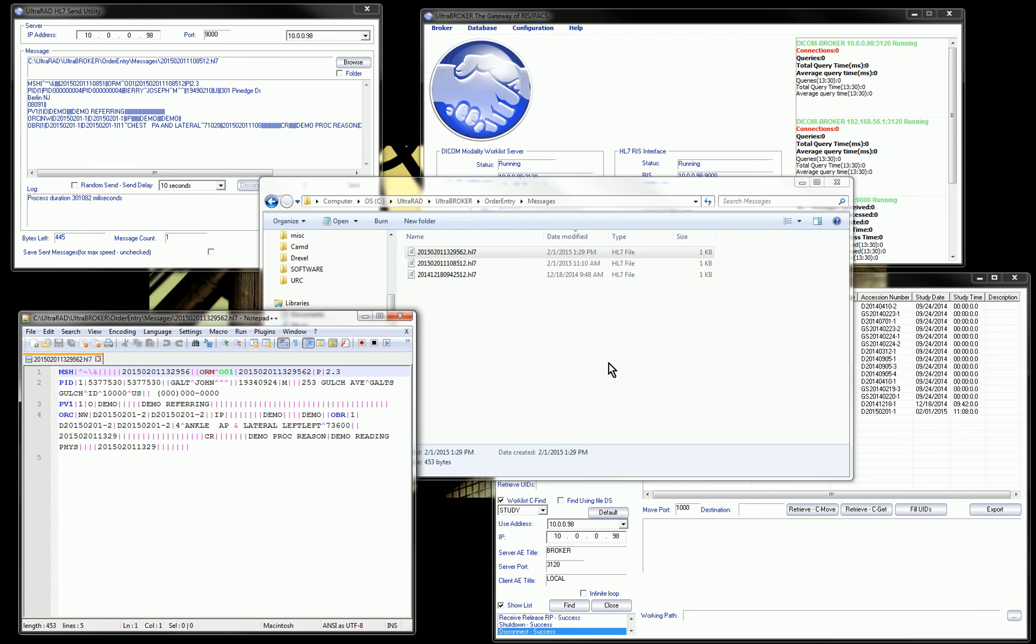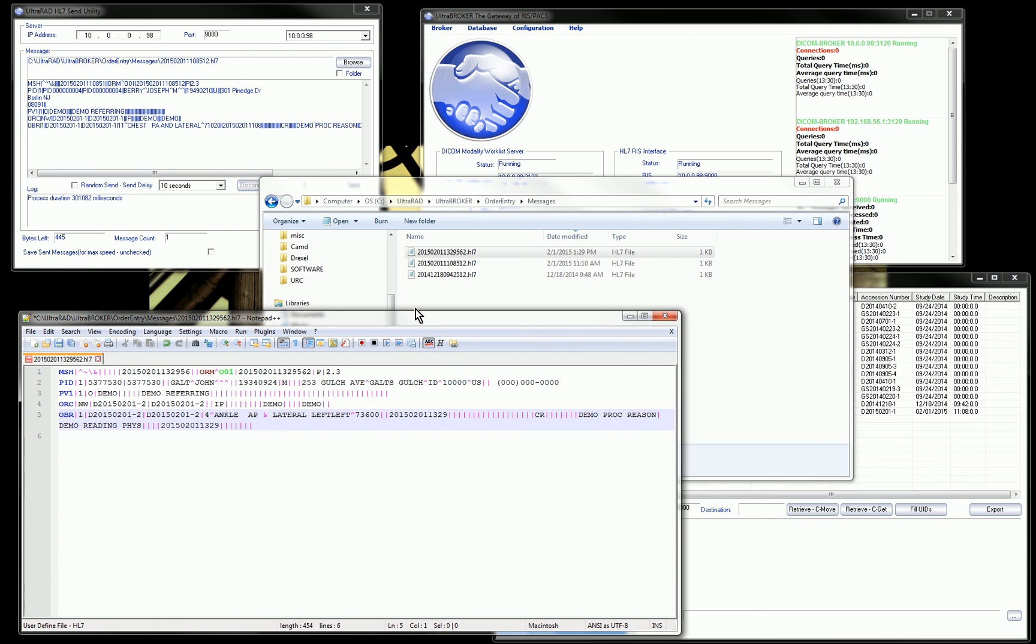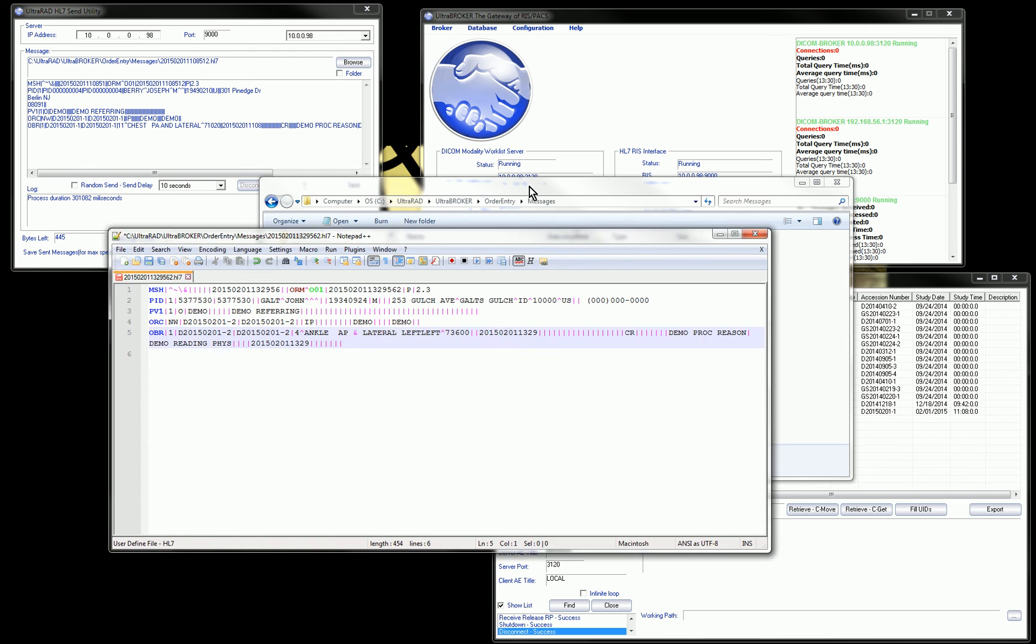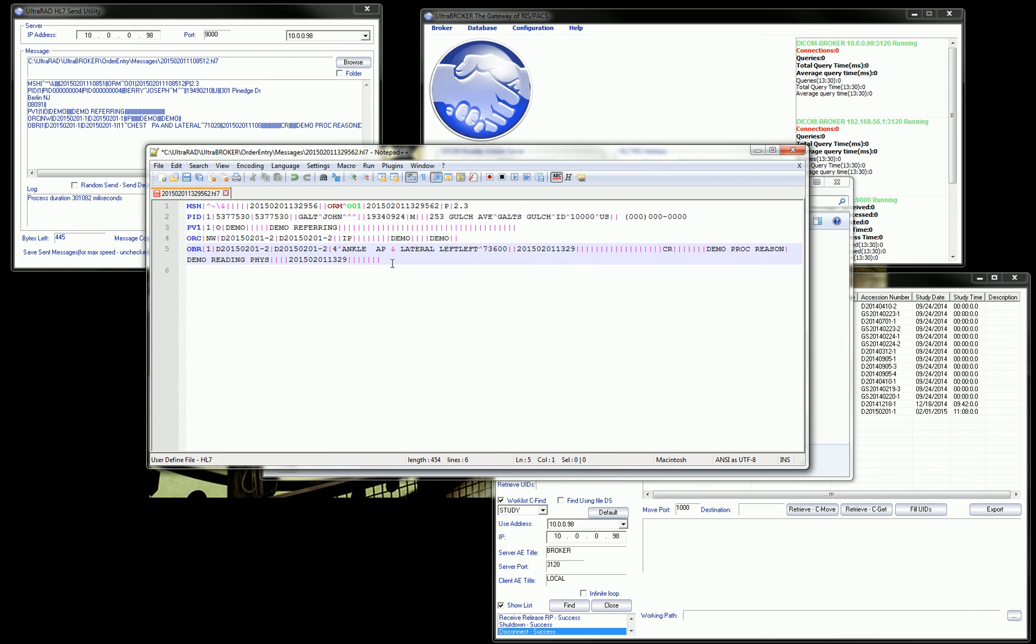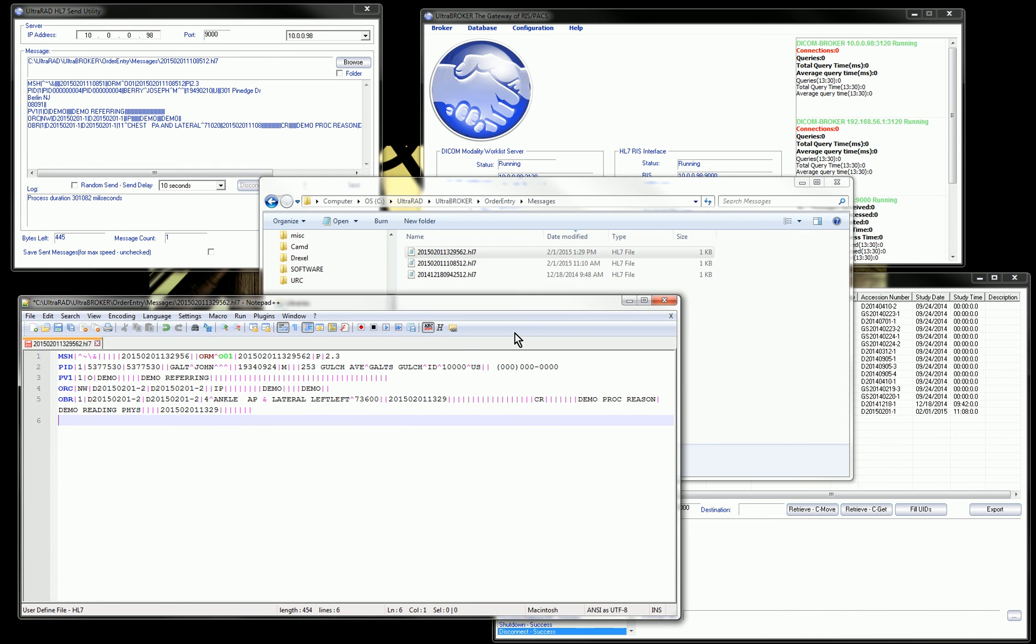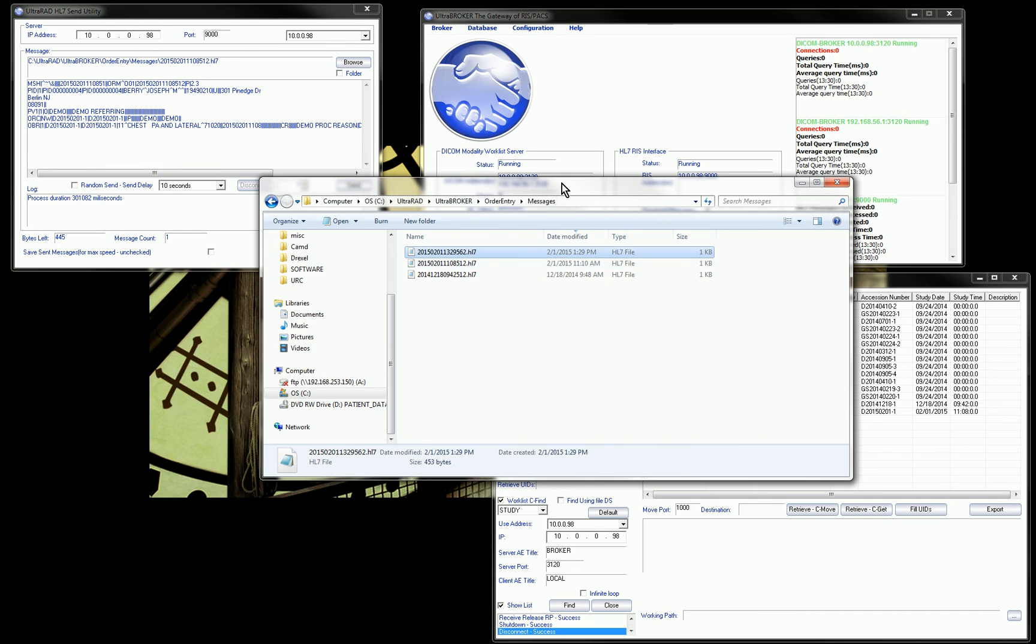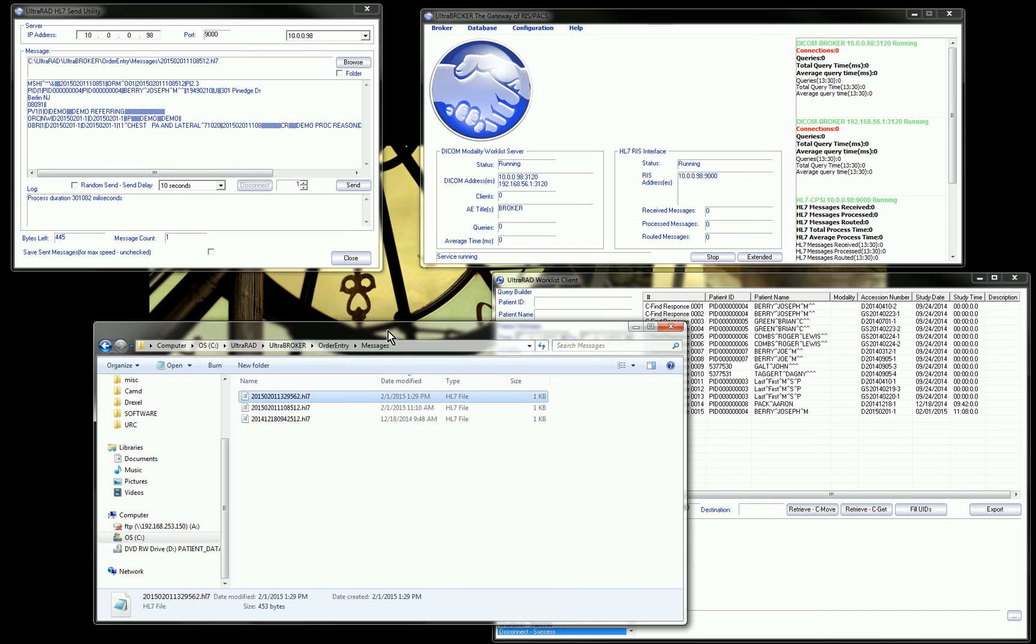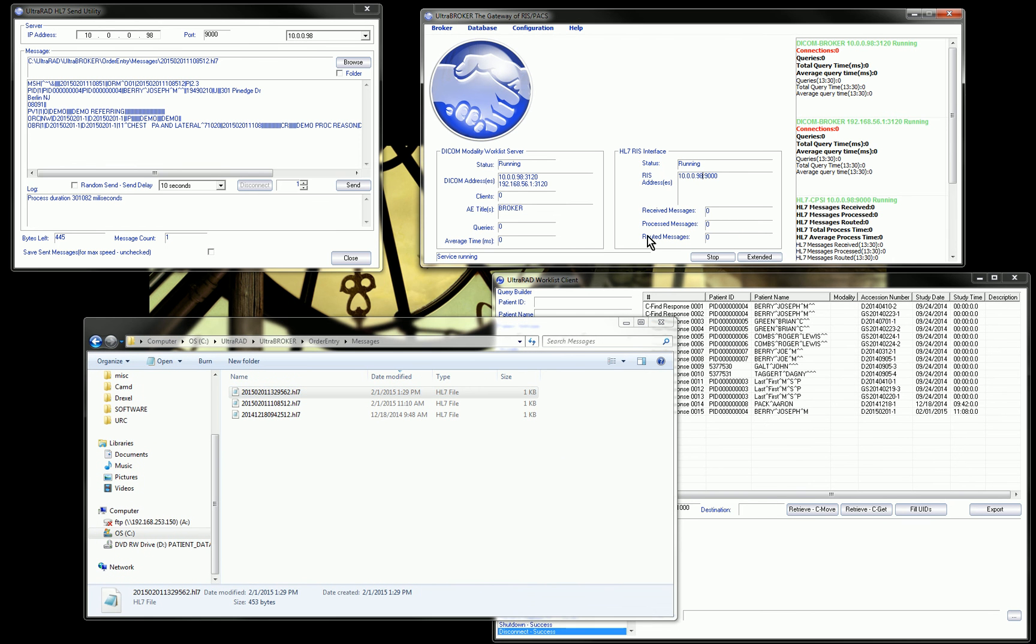Let's take a look at that message. This is what a typical HL7 message is going to look like. This is a very basic HL7 message that you see here. I have a very watered down version just for demonstration purposes. We've got our patient ID, patient name, date of birth, sex, what type of study is being ordered, things of that nature, the modality. All the basic information would be found here. This is pretty typical for HL7.